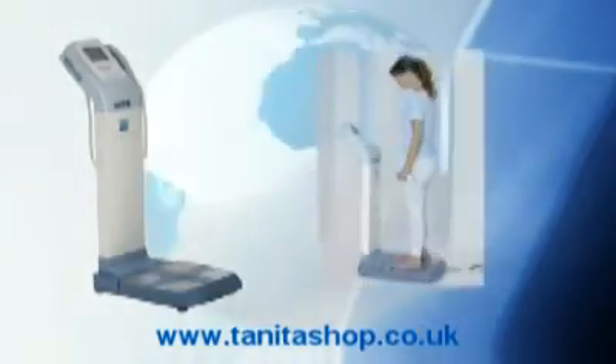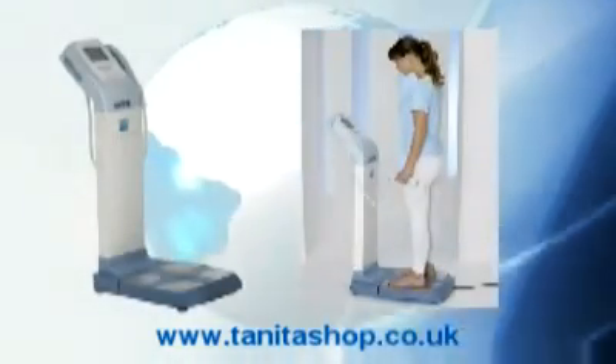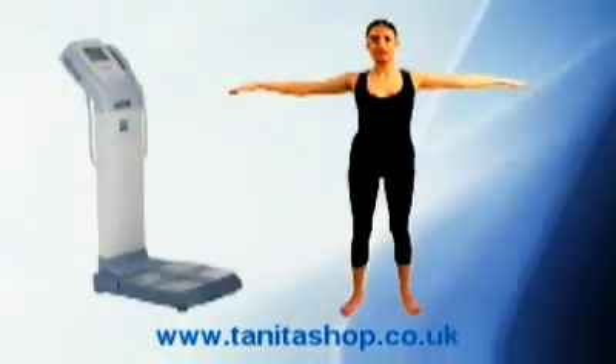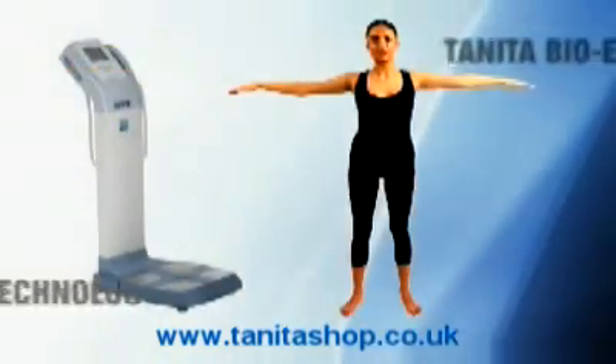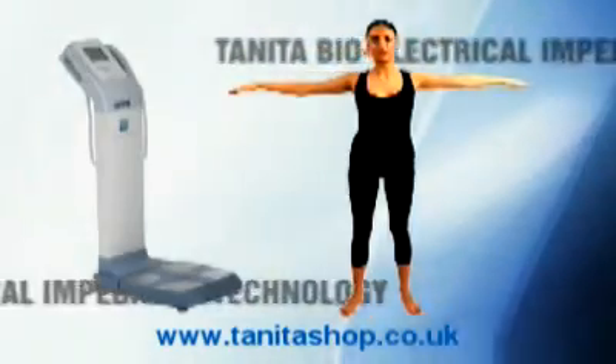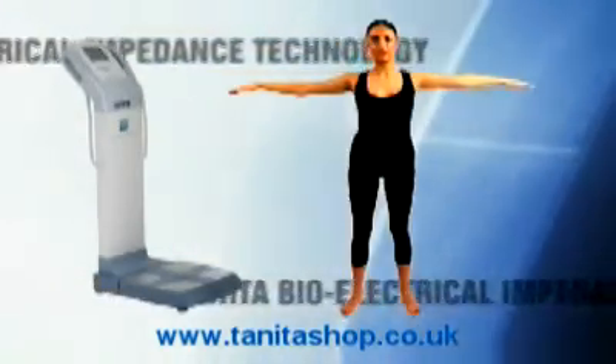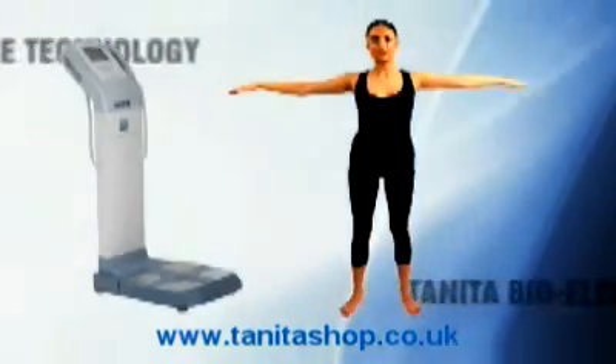Already a best-selling product in the Tanita range, the MC180 is used internationally in medical facilities, fitness centres and research organisations. The eight electrodes use four frequencies to allow heightened accuracy to measure each arm, leg and the trunk area using clinically validated Tanita BIA analysis.